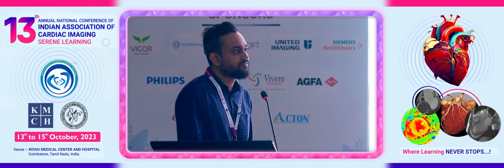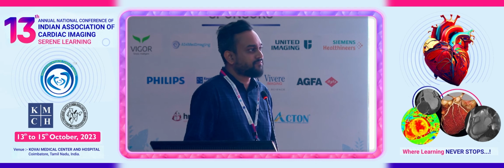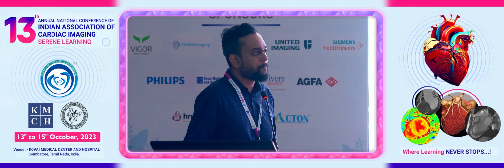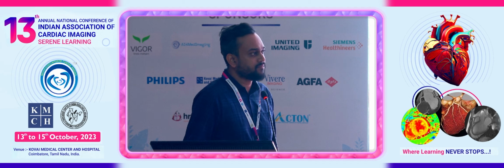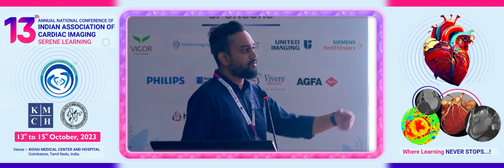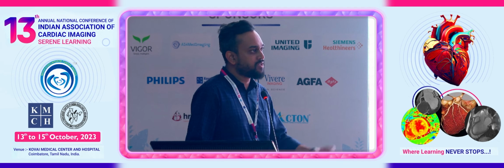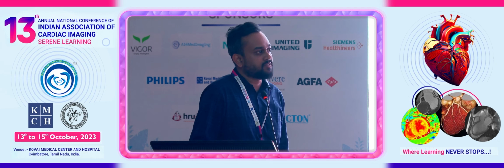I would not say that one should do a cerebral DSA in all these cases, because myxomas are common tumors. So unless there is a very good reason, like a hemorrhagic stroke patient, like in this case, only then perhaps cerebral DSA must be done, but not otherwise. Yeah, we are waiting for this patient to come back and we will do the second DSA after the resection. Probably we can compare the aneurysm size and follow up.